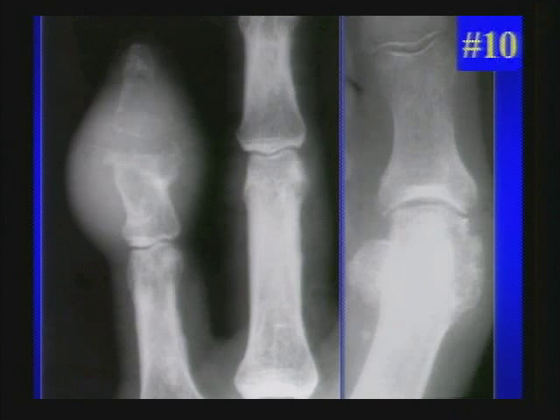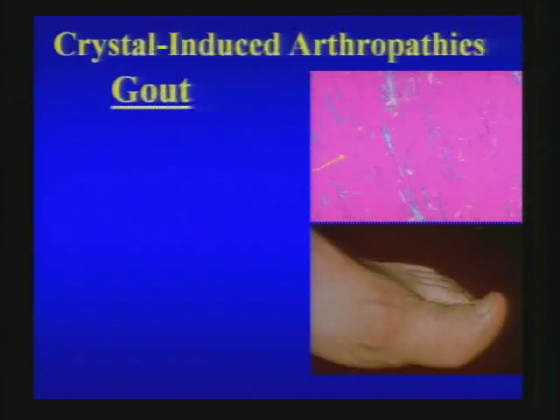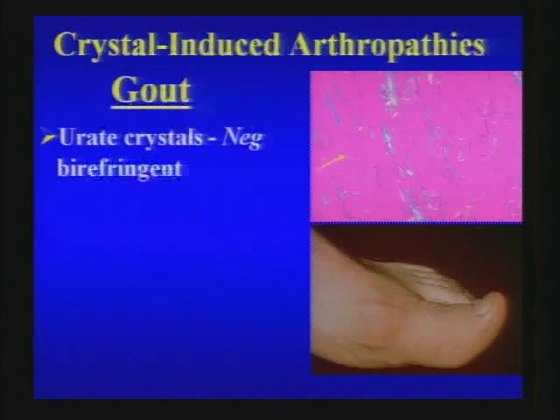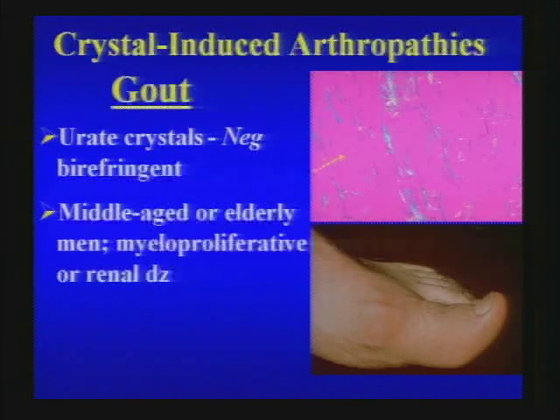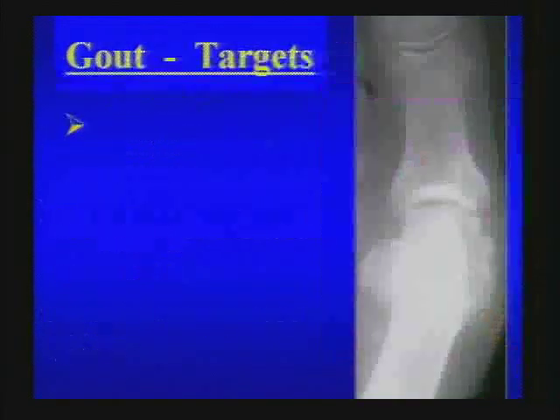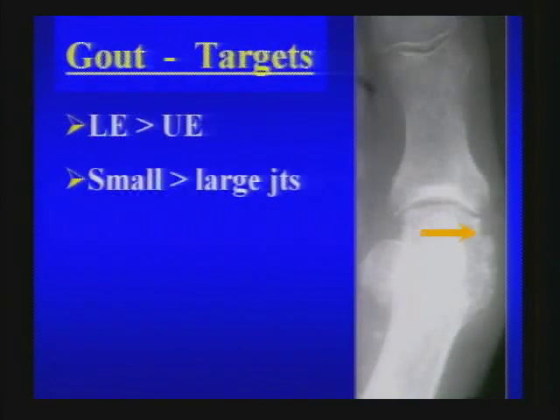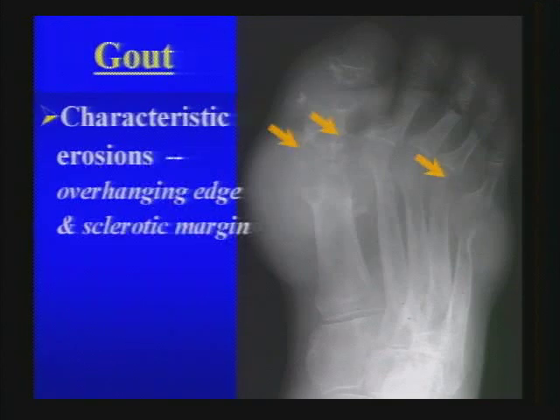Two patients with the same diagnosis: gout. Erosions are very helpful in your systematic approach. Gout is most common in the lower extremity, particularly small joints — possibly related to lower temperature in distal joints. Characteristic sites of erosion are the MTP joints. Look for erosions with overhanging edges, often with a sclerotic margin, and an adjacent soft tissue mass from a gouty tophus causing the erosion.